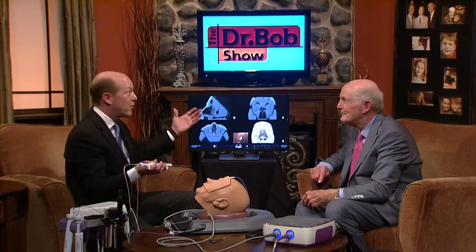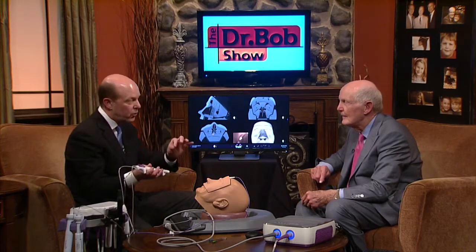And we can guide that signal using some screenshots of the CT scan, in addition to using our endoscope to be able to see the anatomy. And it's much more effective. It simplifies things for us. It cuts down on time and discomfort for the patient.